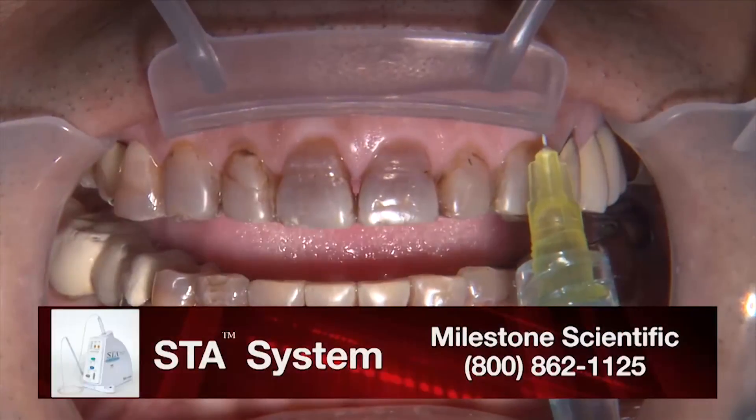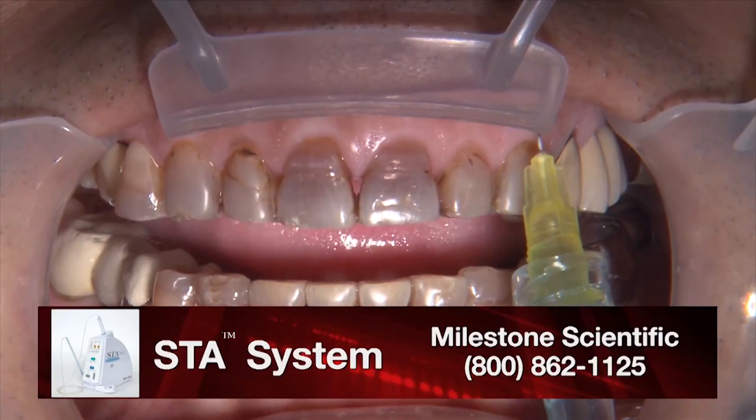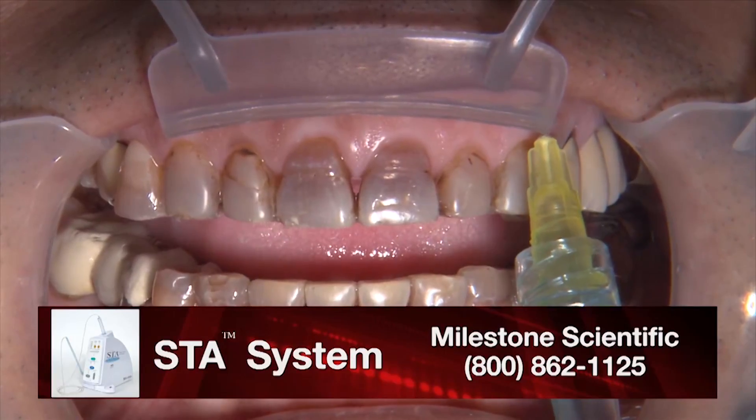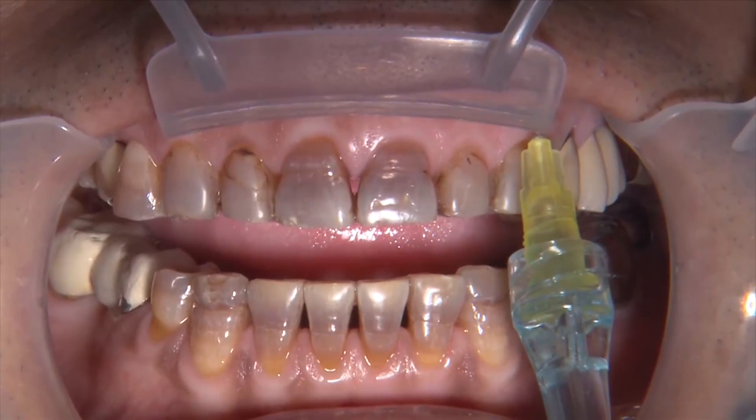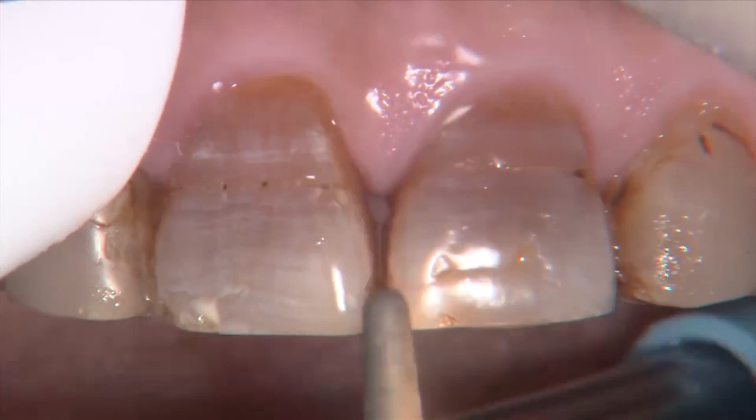I'm not sure why we took a shade there — we could pick any shade that we want. I'm not sure what we thought we were going to try to match. I took the easy shade advanced and put it in just to shoot that shade and see if smoke poured out the back of it, or if it just said C4 plus or something like that.